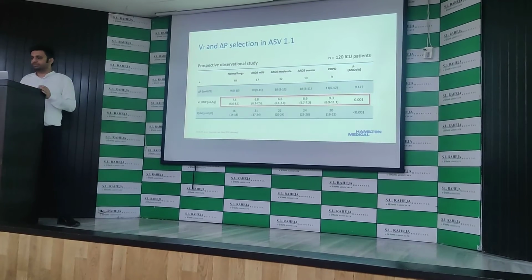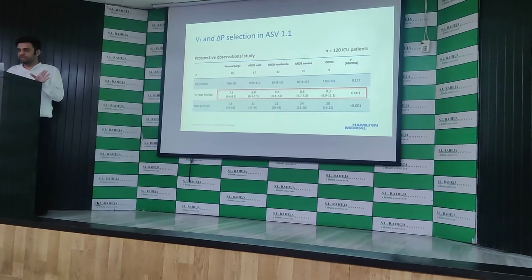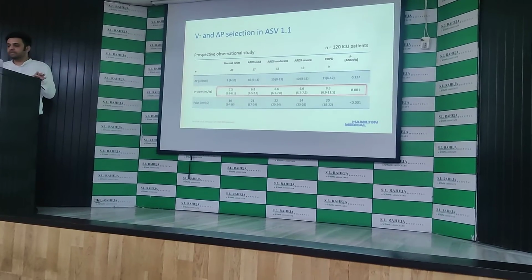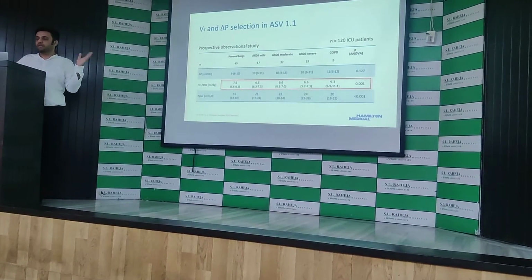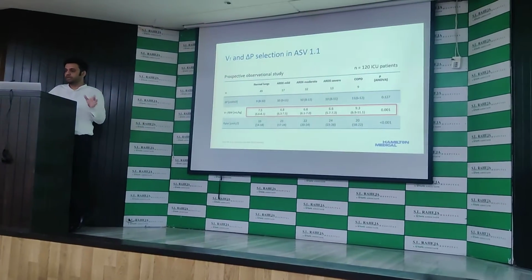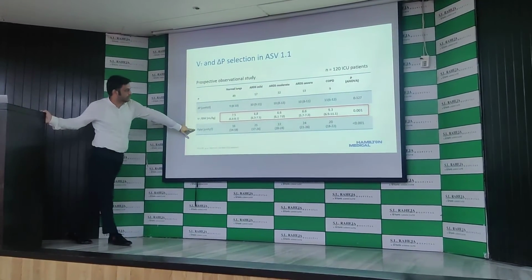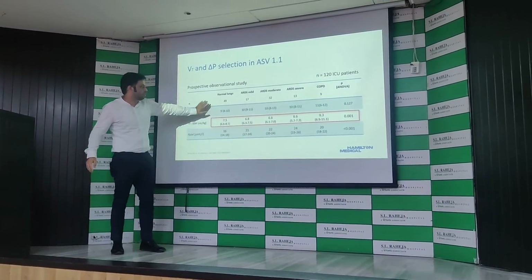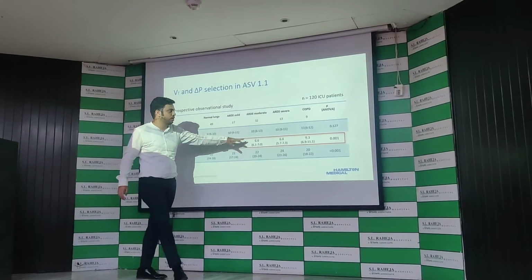So moreover, ventilator-induced lung injury can be prevented by limiting the driving pressures and the tidal volumes. So the ASV algorithm determines, for a given minute volume, the respiratory rate and the volume combination associated with the minimum work of breathing. So plateau and the total peak. So if you see here the plateau and the change in the pressure, and these are the volumes which have been achieved for the normal lungs, 7.5 ml per kg for the ARDS mild, moderate, and severe.